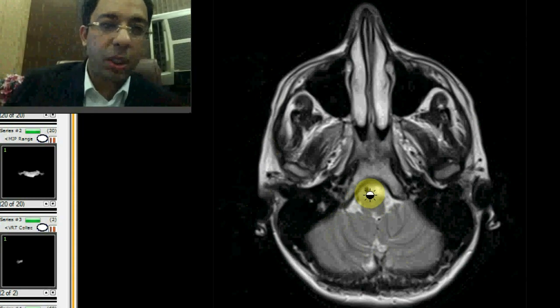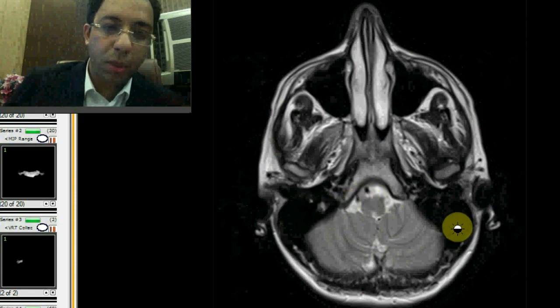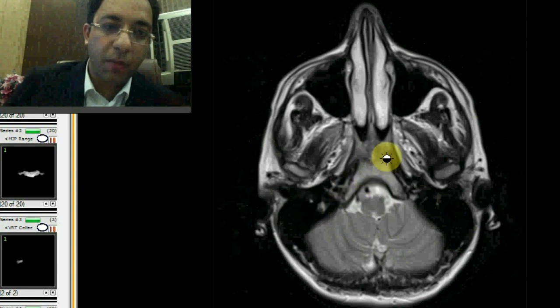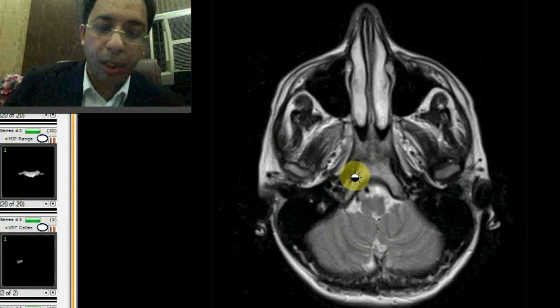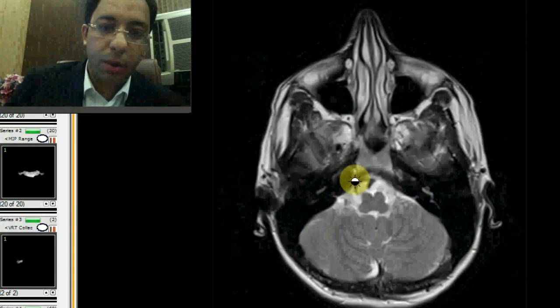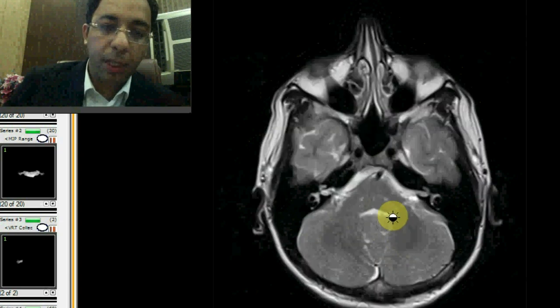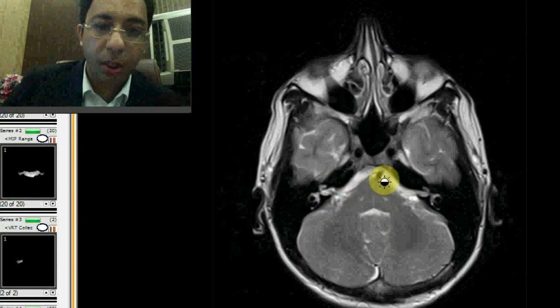These are the vertebral artery flow voids that you can appreciate. This is the area of the mastoid — you don't see any fluid here, which is normal. This is the clivus, where you would look for a potential tumor. As I go up, the vertebral arteries appear to merge. This is the medulla, and you can see the cerebellum, the seventh and eighth nerve complex, and the basilar artery.